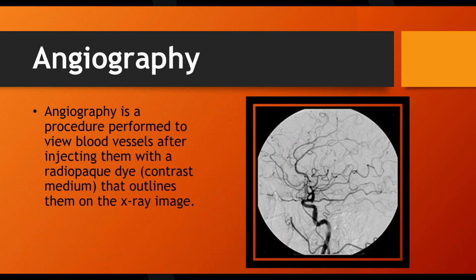Now this image right here is a brain scan. The white background is basically the plate, or the IR plate, that caught it. The dark areas here are the blood vessels filled with contrast. So if there were none of this fluid in this machine, this entire image would be pretty much clear or pretty much white. You can see the thicker, darker areas, how thick some of them are filled with contrast and how well they show up.